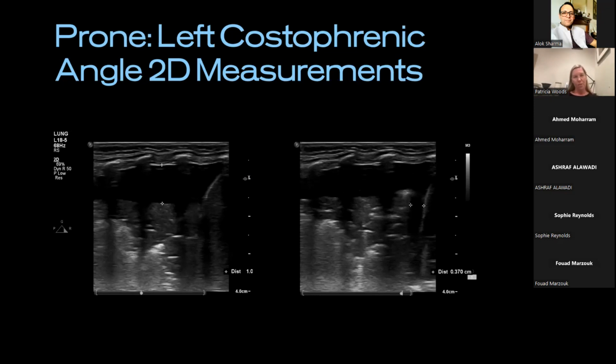But, you know, so what, as the baby breathes in, breathes out, what's the impact? So sometimes I like to take 2 or 3 measurements. So I just get that idea with diaphragm movement, with inspiration at its greatest, what's the impact on the lung?